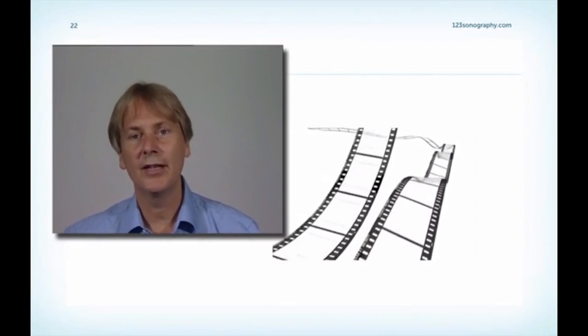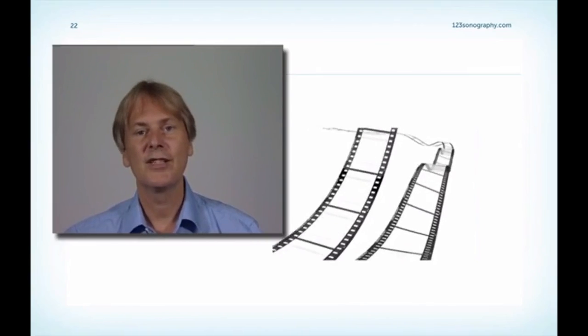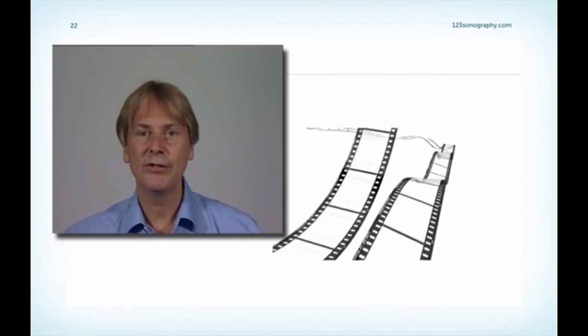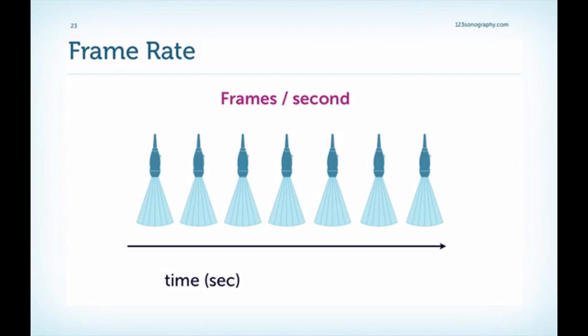But with echocardiography we're also interpreting moving structures such as heart valves and the myocardium. So it's very important to also understand how moving images are created and which factors influence them. To understand how moving images relate to the quality of ultrasound, it's important to use the term frame rate. Now, frame rate is defined as the number of images, or pictures, which are displayed within 1 second. Just to give you a better appreciation, in PAL television we have frame rates of 25 frames per second, while with HDTV we have frame rates of 60 frames per second.